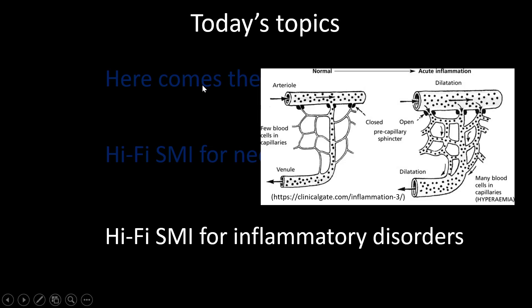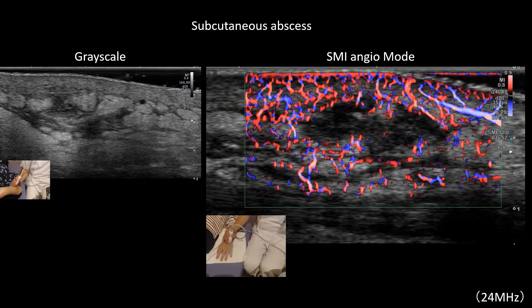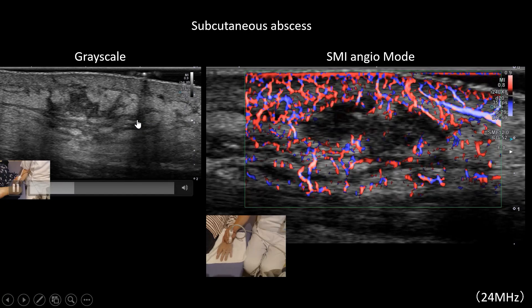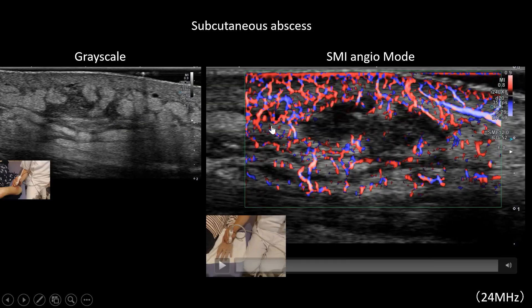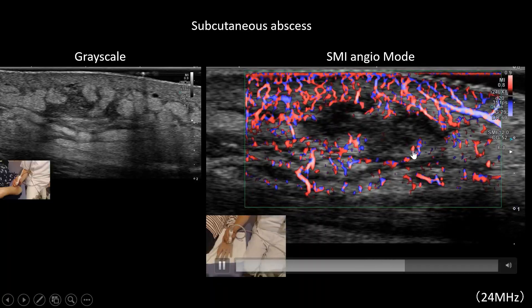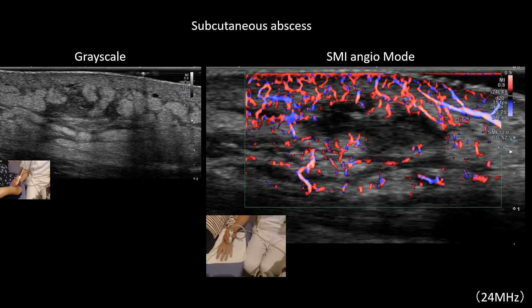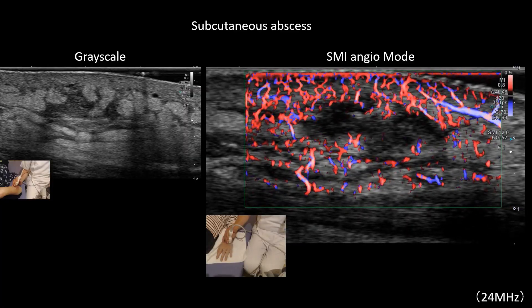Let's move on to Hi-Fi SMI for inflammatory disorders. This is a subcutaneous abscess of unknown cause — she felt pain in her wrist. On grayscale you can see a hypoechoic area in the subcutaneous region. SMI Angio Mode shows a rich vascular structure caused by inflammation and hyperemic state, and you can also see an avascular area representing abscess.